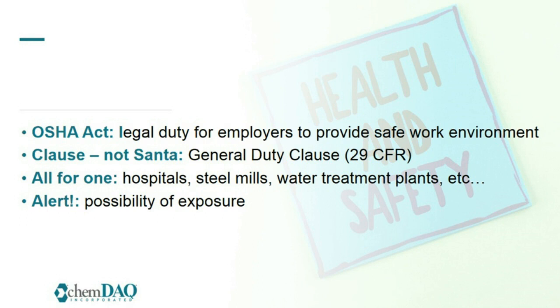29 CFR 1910.1000 provides maximum PELs, or permissible exposure limits, for specific compounds. For example, hydrogen peroxide is calculated at 1 part per million per 8-hour time-weighted average. In 29 CFR 1910.1200, it says that it's intended to inform employees about the hazardous chemicals that they are using. HAZCOM, which refers to the signs that we see in the departments, involves labeling of chemicals, the use of safety data sheets, and especially training.